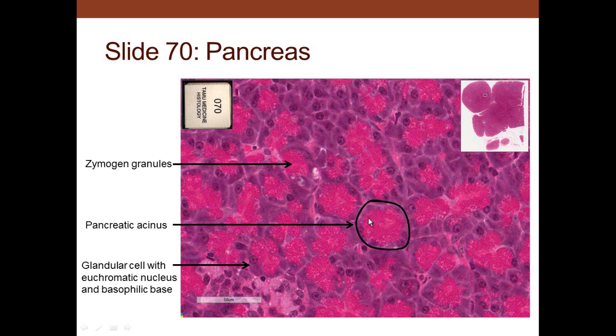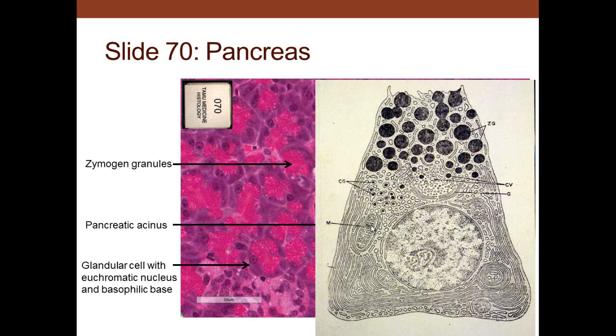So hematoxylin is staining the nucleus dark, and the base cytoplasm, which is rough endoplasmic reticulum with ribosomes thereon, dark, and then the red eosin is staining the zymogen granules. So you see the base blue, nucleus blue, apex is proteinaceous, and here we can see the individual cell rough endoplasmic reticulum, the blue through there.